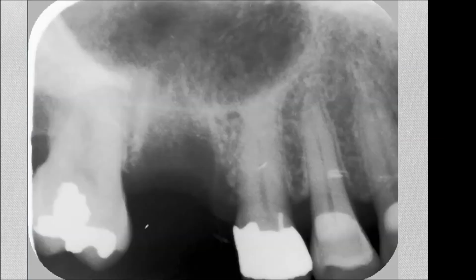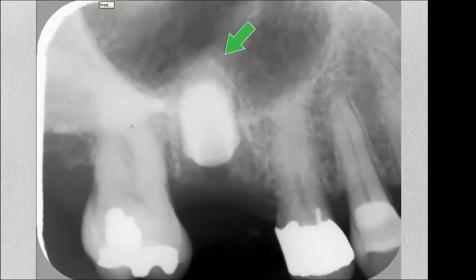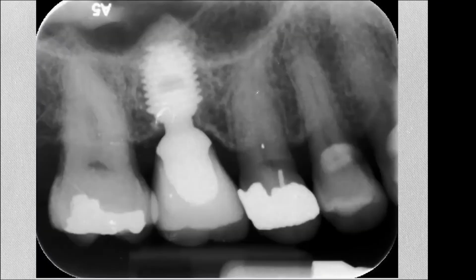Now, you can sometimes, if you have plentiful autogenous bone, use that in cases like this one where we place a short implant. When placing autogenous bone, you just have to get the x-ray just right so you see the shadow of the lift. And yet, as it consolidates over months, that bone becomes more and more defined. And then when you put it to function, the definition increases. And then after about 2.5 years in function, you see that this has been maintained, okay? And so this is what we see with our sinus lift with SynthoGraft.